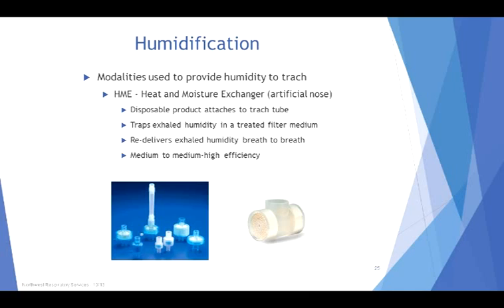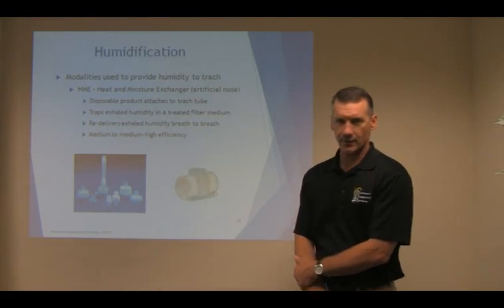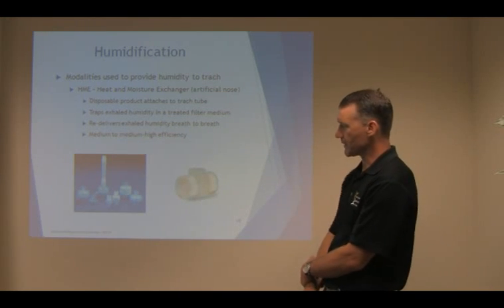We do have some issues. If the resident coughs, they can plug this up. So we have to be very diligent in keeping it changed.